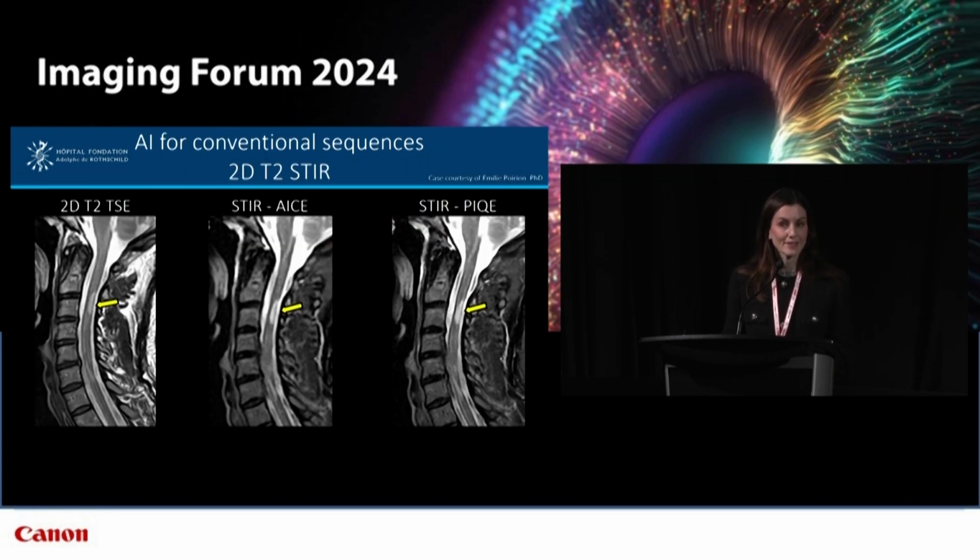Next up then is spinal cord imaging, which is not necessarily everyone's favourite. Conventional MR techniques have their limitations. The spinal cord is a thin structure, it requires a large field of view, scan times are long, prone to motion artifacts, and sequences require higher resolution, higher SNR, and motion robustness. More advanced sequences are needed to address the complexities of conditions like MS.